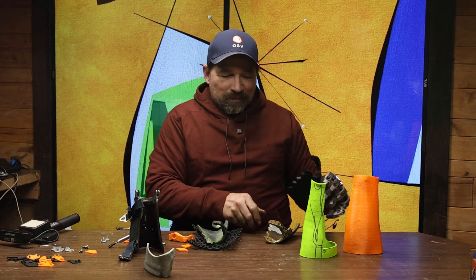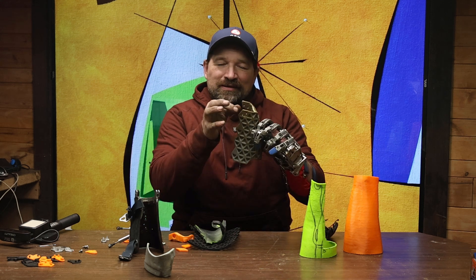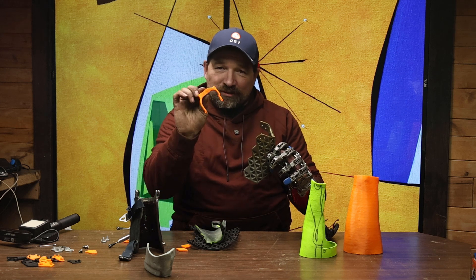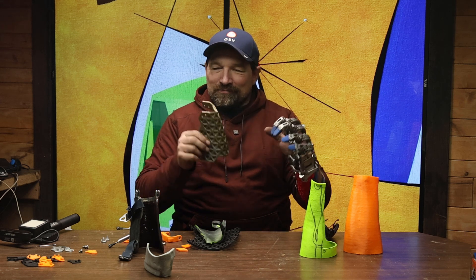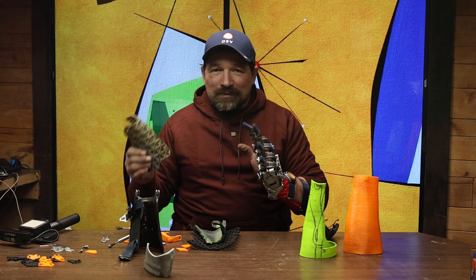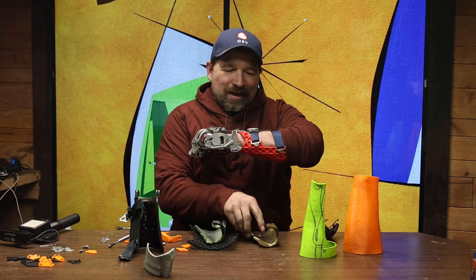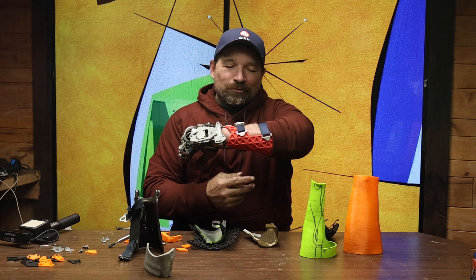From there I got a version 2 that's a little bit closer to what I want, cleaned it up, trimmed it, added the hard connection points for the gimbal, then scanned it back, did a little bit of digital cleanup and refinement — and I think this is going to be the final iteration of it.